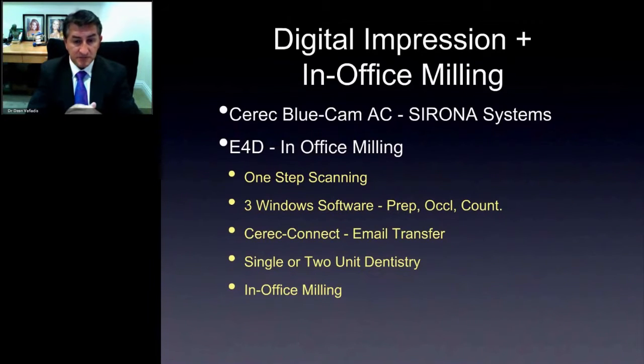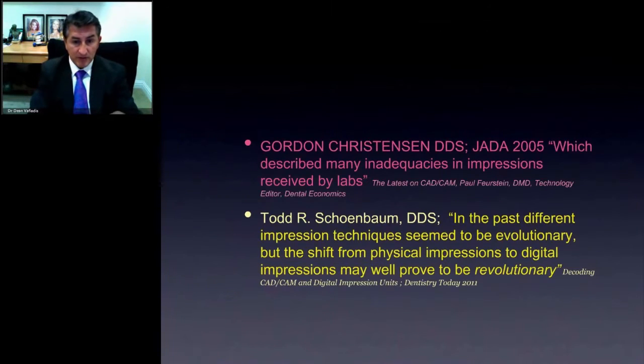For the in-office milling, again, for us, it's saving time of a second visit. It's saving the patient time of coming back and getting a second injection. It's getting us more control on the final restoration. And, of course, we know that dentin that's prepared and enamel that's prepared is a lot better when it's sealed the same day. So you're getting one visit, preparation, and seal the same day, which could help you with the sensitivity long term. So that's really been a big help.